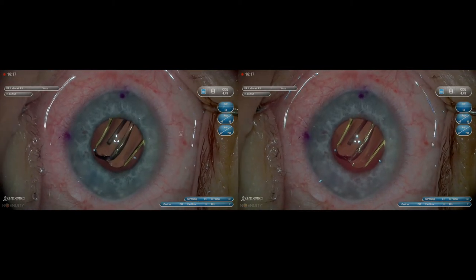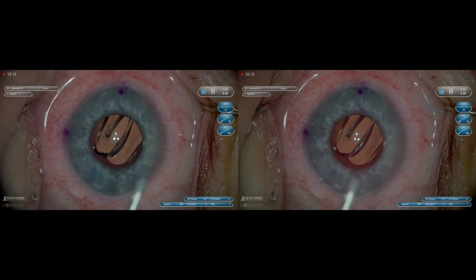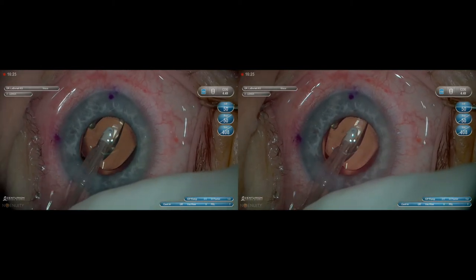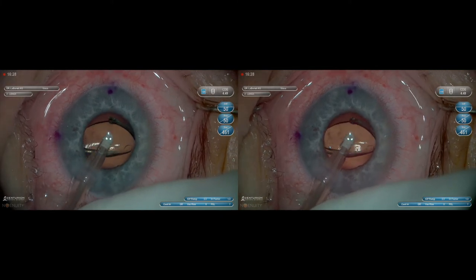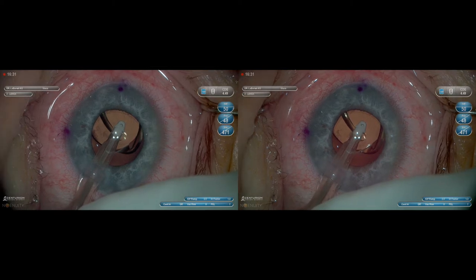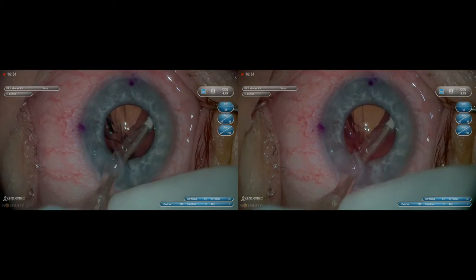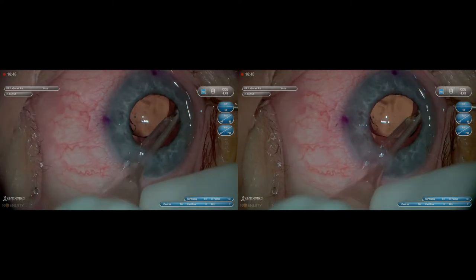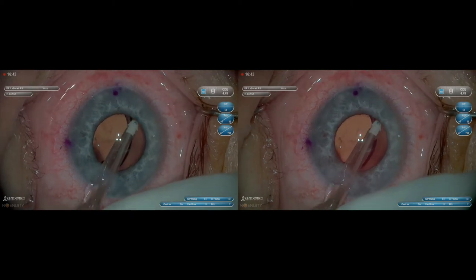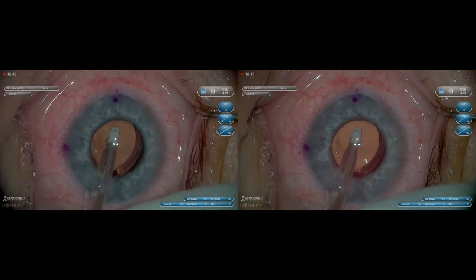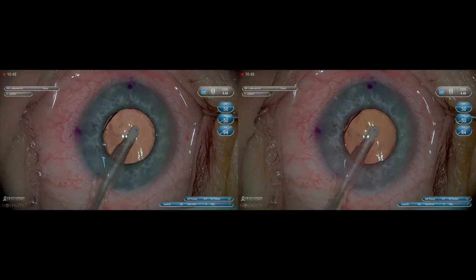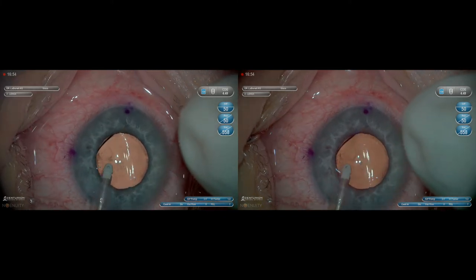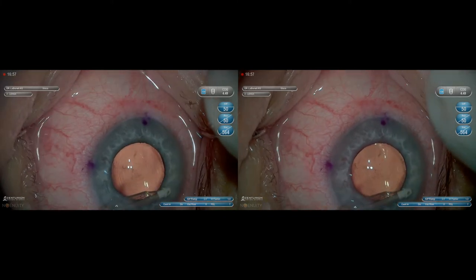It's nice during lens insertion to sometimes shift my shoulders and elbows to allow me to line up with the primary incision for insertion and then angle down without distorting the cornea — because my eyes don't have to be locked in at the microscope. I can sit anywhere as long as I can see the 55-inch monitor, which is about 4 to 6 feet away. I'm also more confident to, when necessary, go under the IOL to remove viscoelastic, since I can see clearly all the depth within the anterior chamber.